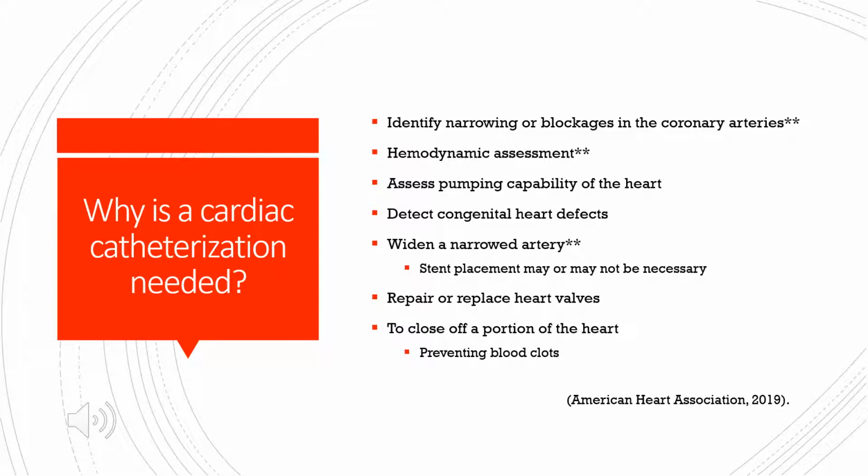So why is cardiac catheterization needed? Cardiac catheterization is a medical procedure that can be utilized to diagnose and treat certain cardiac conditions. Your doctor may recommend cardiac catheterization to find out the causes of symptomology associated with chest pain or irregular heartbeat. In addition, cardiac catheterization can be utilized to assess whether the patient has ischemic heart disease. Ischemic heart disease can be caused by atherosclerosis, which causes narrowing or blockages of the coronary arteries.